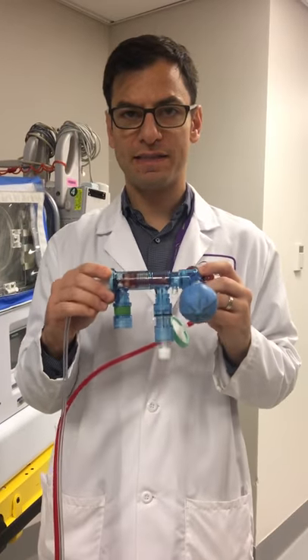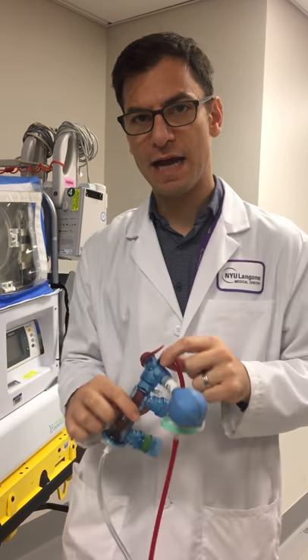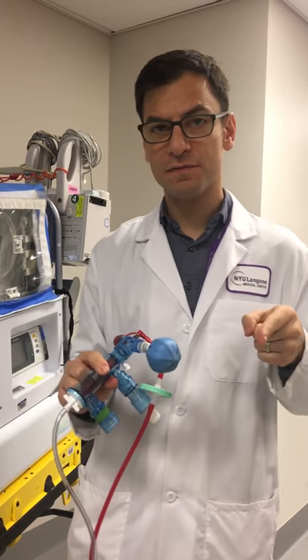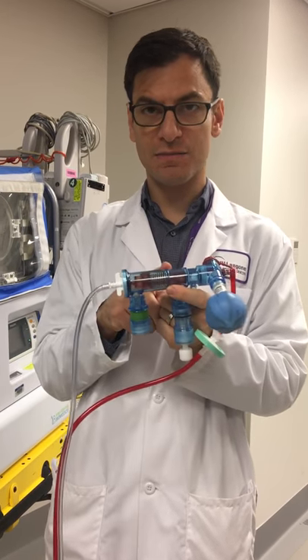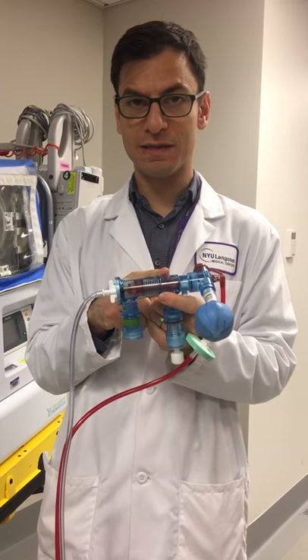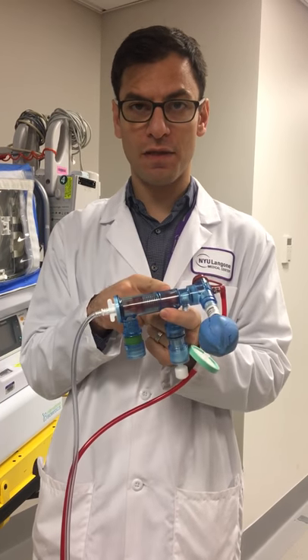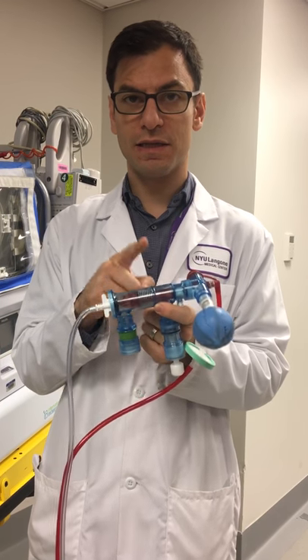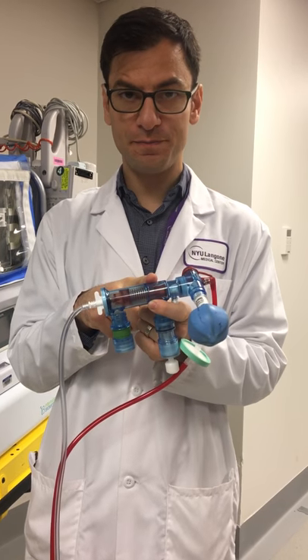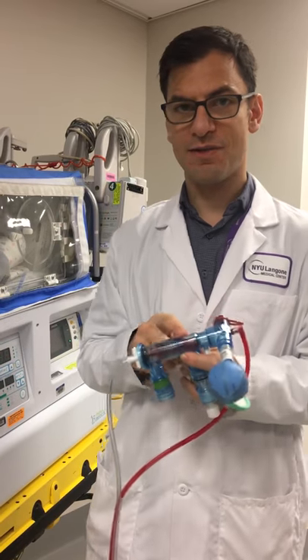That's high frequency transportation — very basic instruction on how to set it up for the patient and how to use it. We're never going to leave right away. When we pick up the patient, we're going to put them on this system and monitor them for at least 30 minutes. Get a blood gas while they're on this, get a chest X-ray while they're on this, and monitor that the patient is stable and tolerating this therapy or ventilation before we put them in the isolette and move them out.